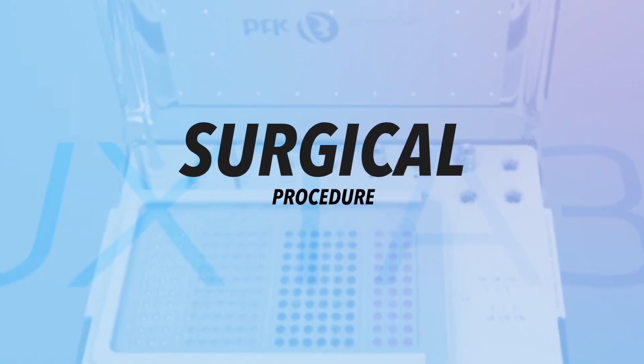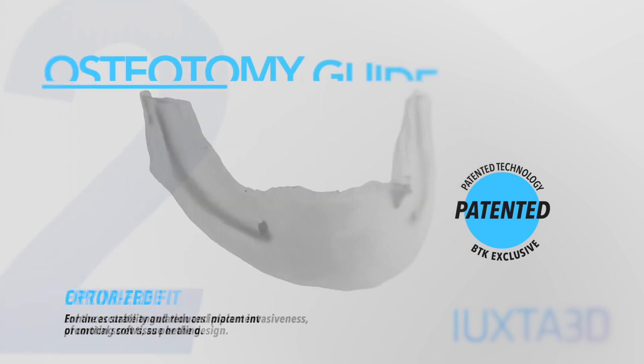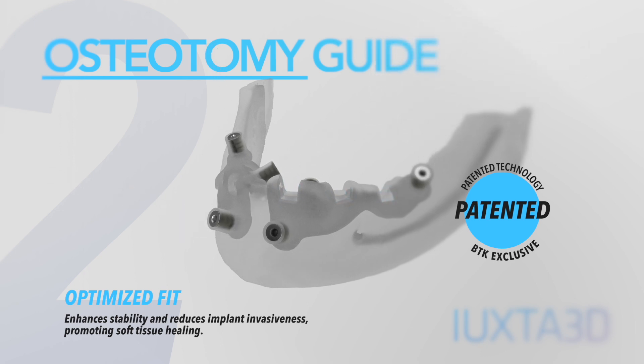The Surgical Procedure. The patented fixation guide prepares the screw placement precisely as per the digital design. The osteotomy guide ensures greater stability and reduced invasiveness of the Uxta 3D implant, promoting soft tissue healing.